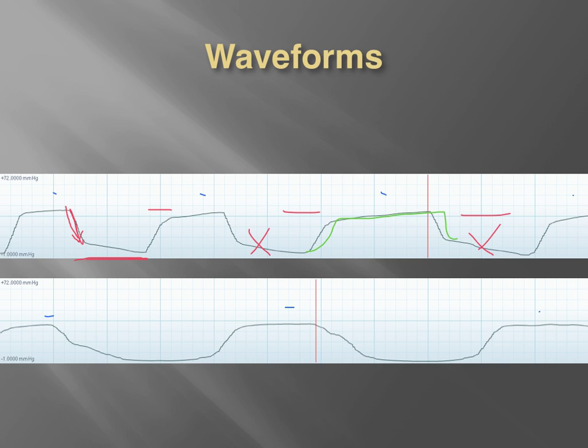But there may be some reason that this patient is rebreathing carbon dioxide, okay? It could be from being on PEEP or CPAP. If you think about CPAP causing that restriction of exhalation, you may actually be retaining a little bit of carbon dioxide over time, causing your baseline number of 0 to actually rise, okay? Something to be aware of, and if you see it, it's definitely worth figuring out what's causing it.